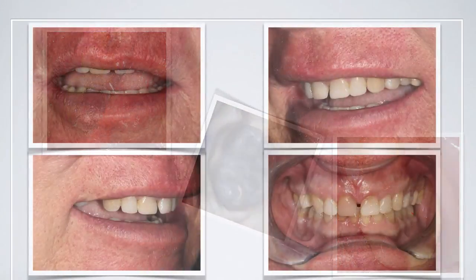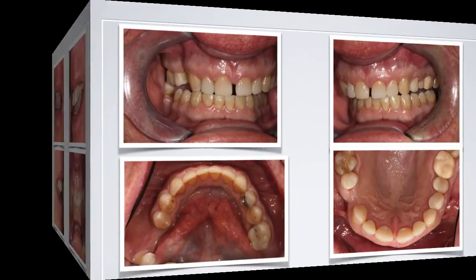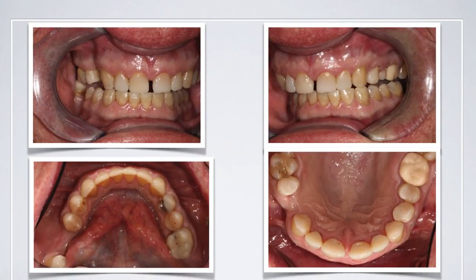A couple of hours later, we end up with Elwyn's mouth restored and an occlusal relationship which we think is pretty good. We're happy with the appearance and Elwyn was very happy. Originally we were going to go with an A2, but he turned up on the day and changed his mind, wanting to go with an A1 — which is why there's a slight shade shift. We then suggested some post-operative bleaching, which he never quite got around to, being very happy with the result. Three years later, everything is still working very well and the patient has been very pleased.